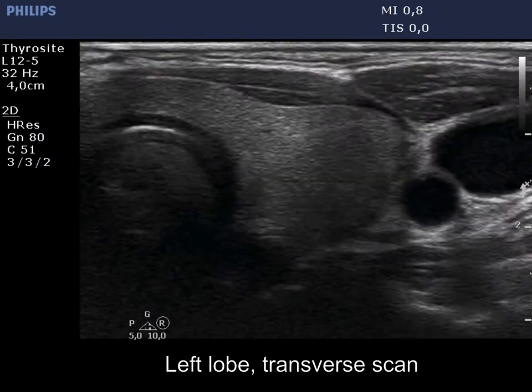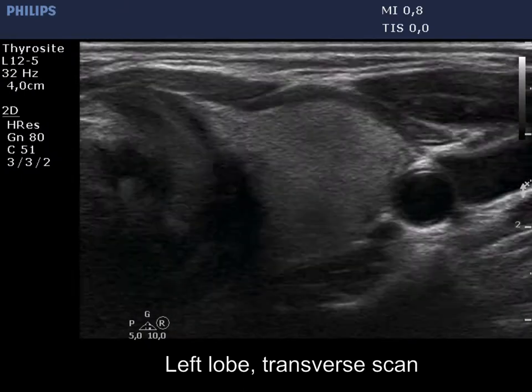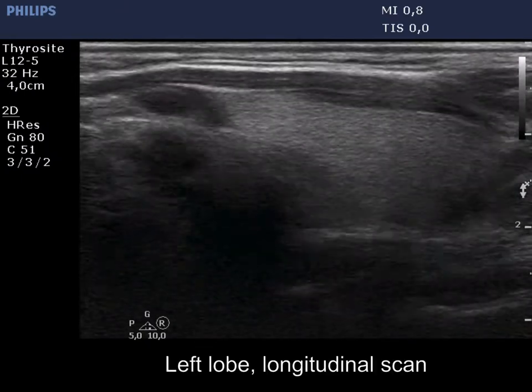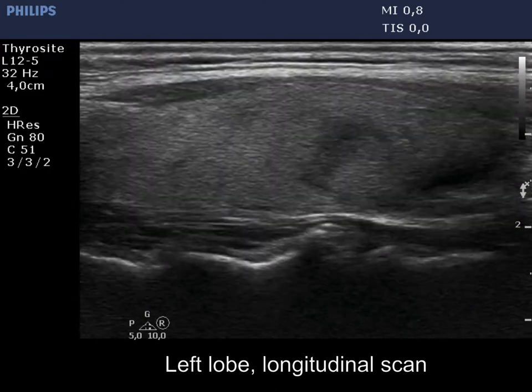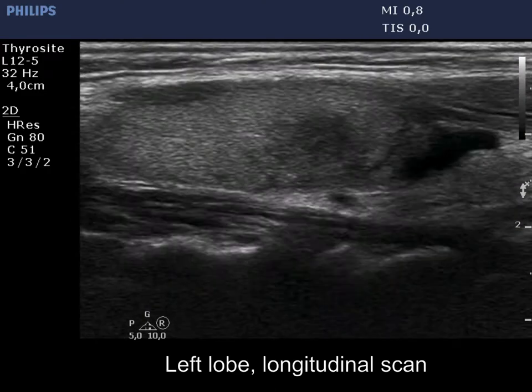The painless left lobe was echonormal and presented a small hypoechoic lesion with the characteristic blurred borders.